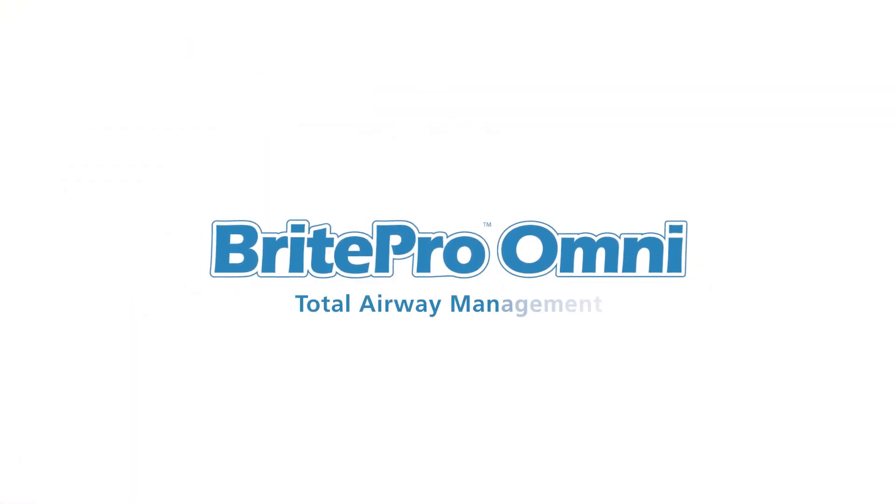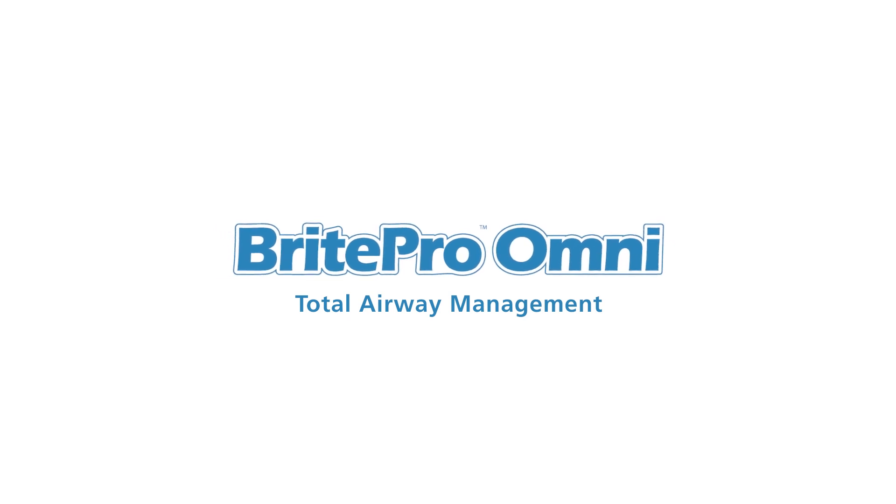BritePro Omni total airway management. For more information, visit us online.